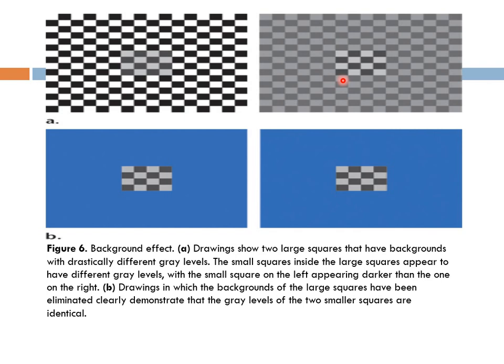So this is the same density as this one. Yes. But the background is different. That's why we see them as different densities. Yes.